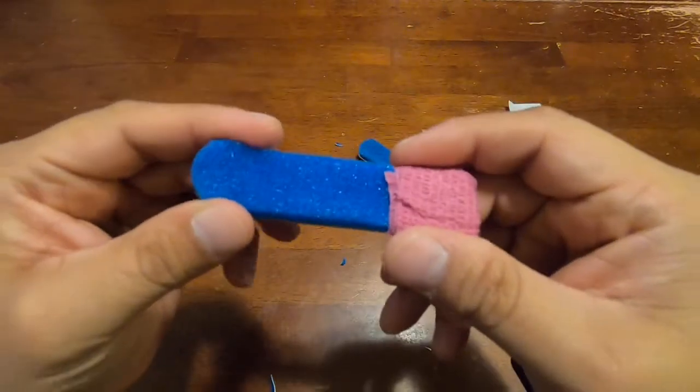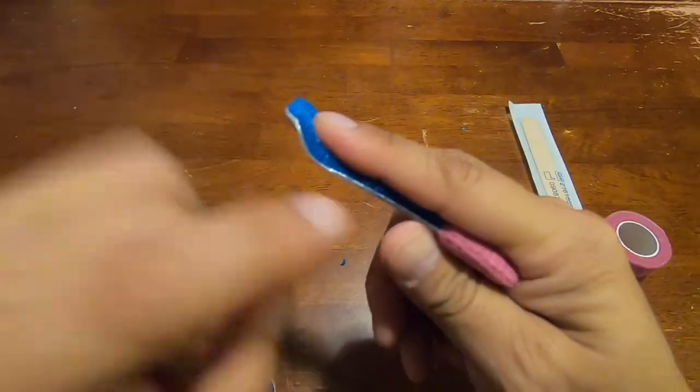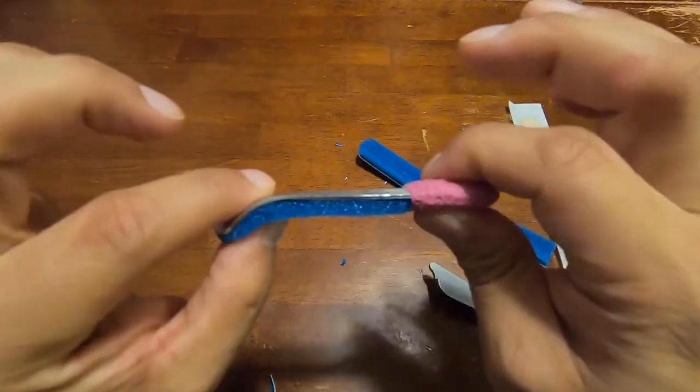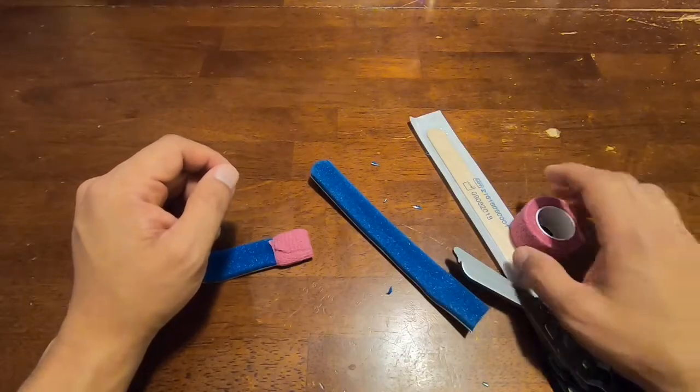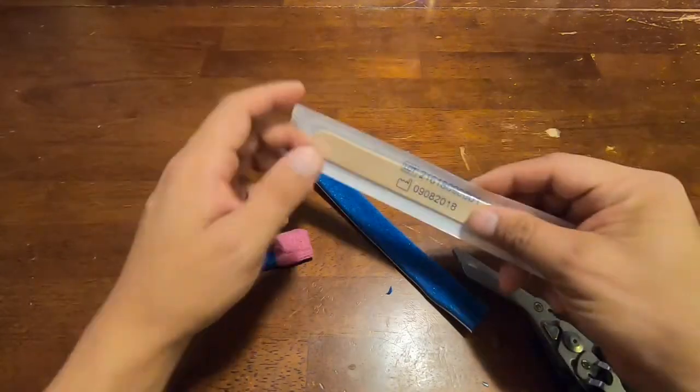So when I apply it, I've adjusted it, I've covered it, and that's a lot safer finger splint. All right everyone, now let's move on to the tongue depressor.